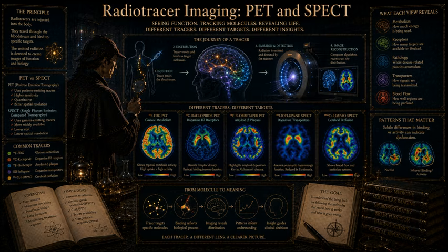It has a very high probability of being attenuated. Whereas a molecule sitting right on the surface of the cortex, just a few millimeters from the skull, has an easy escape route. Precisely. If we do not mathematically correct for this physical reality, the resulting image will be horribly distorted. The center of the brain will artificially look incredibly dark, as if there is no tracer there at all, simply because all the photons originating there were absorbed by the skull, while the outer edges will look artificially bright.